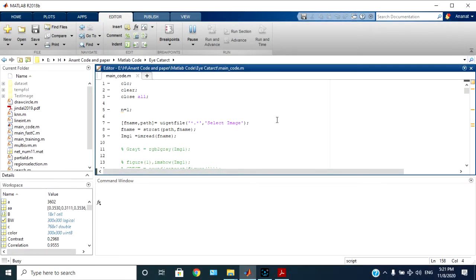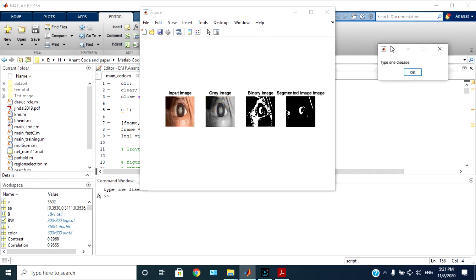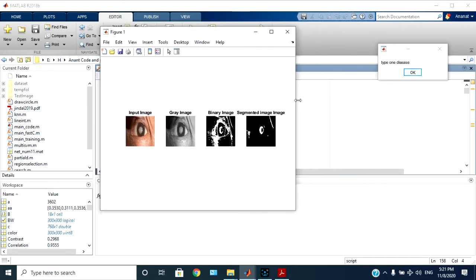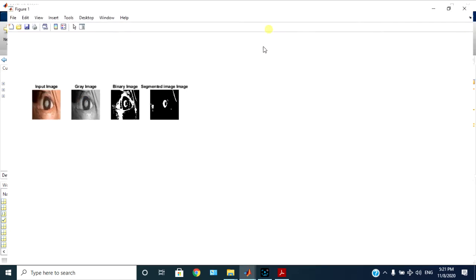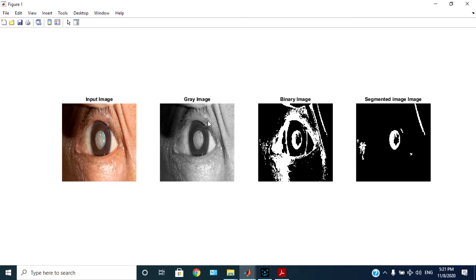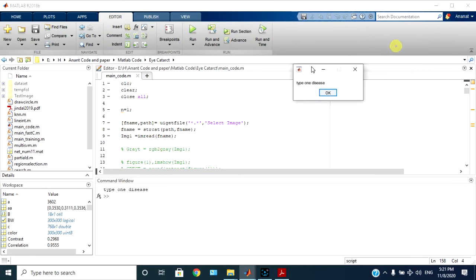Which image has eye cataract, so based on that it will tell what type of disease, type one or type two. So here it will show input image, grayscale image, corresponding binary image, then segmented region, and based on that it will decide the type of disease.